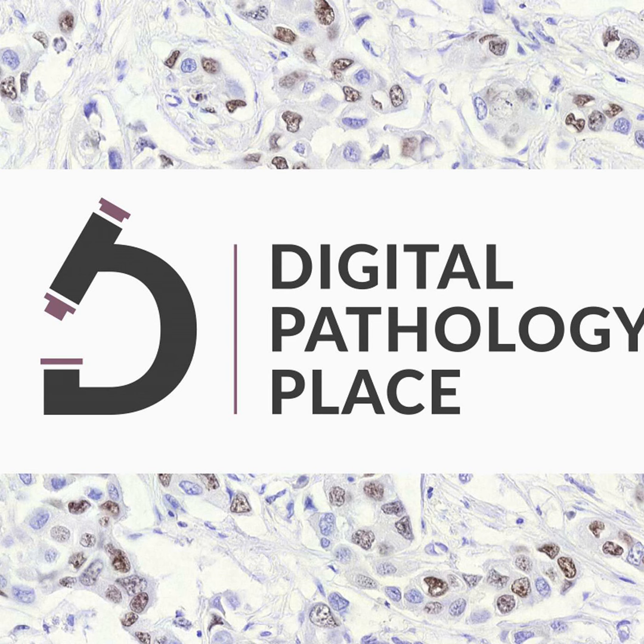So what happened here? Nodal metastasis in sentinel node biopsies is crucial for melanoma staging. Once again, the entity here is melanoma, and there is something called nodal metastasis. This is in sentinel node biopsies, where you take a biopsy from the closest draining lymph node from the lesion, and it's crucial for melanoma staging.